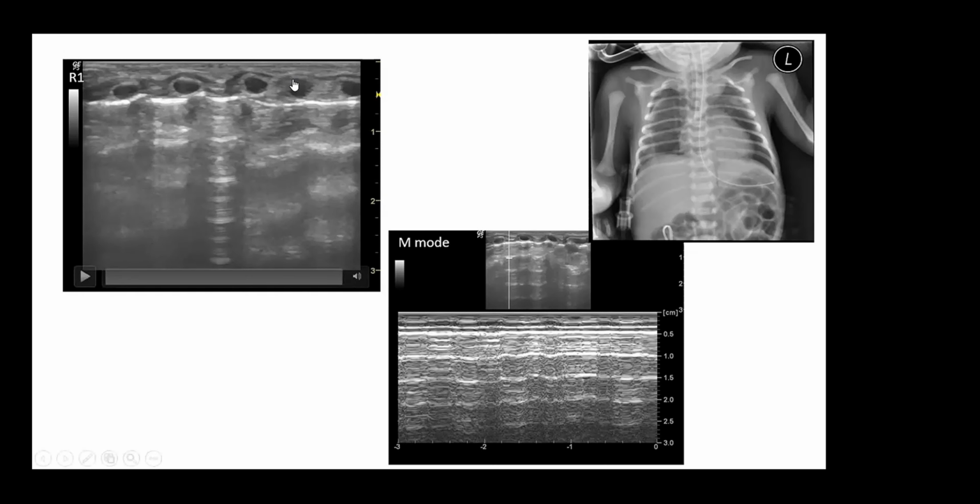And then in the course of my learning, I've gone back to doing lung ultrasound first, thinking of my diagnosis, and then doing a chest X-ray to validate what I think after clinical correlation. And now I think I've reached a level where I feel that actually I don't need a chest X-ray. So what you'll find is all of you will go through this gradually, and using the chest X-ray to interpret your findings would be fantastic.